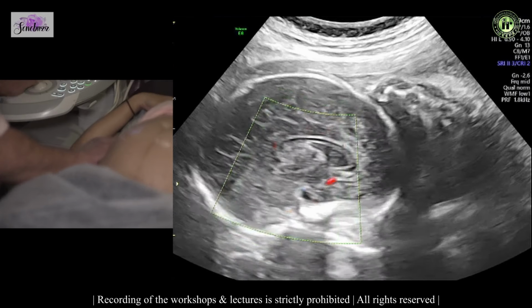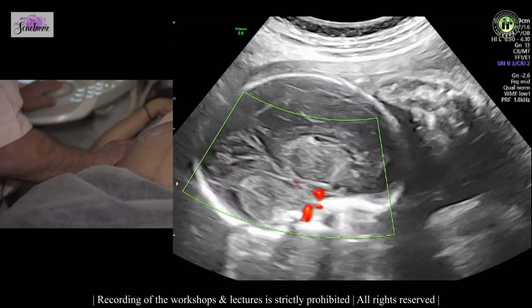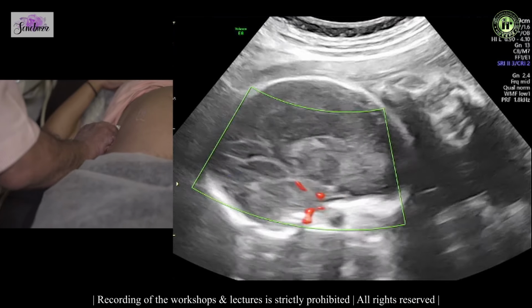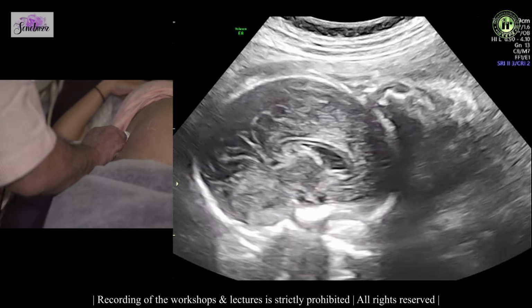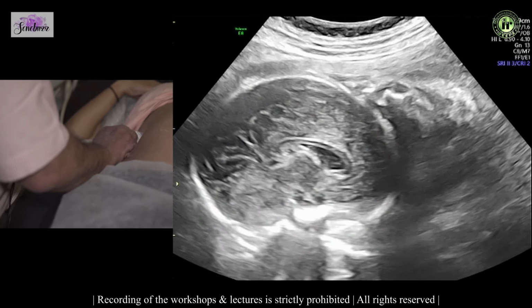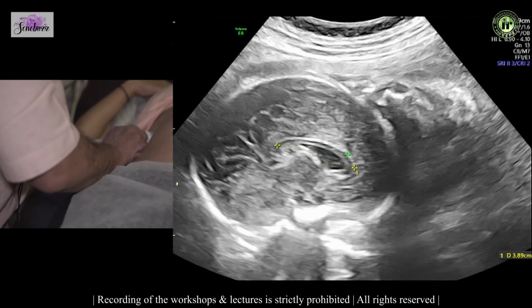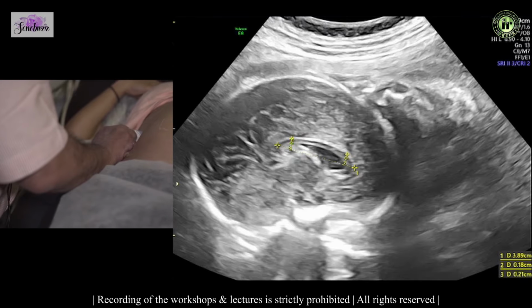The entire length of the corpus callosum. We can measure the length of the corpus callosum. You can measure the thickness at various levels. They are usually symmetrical.